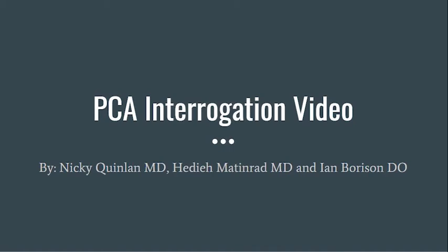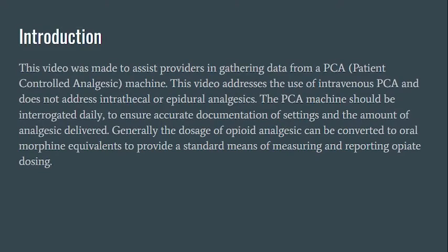This video was made to teach providers how to interrogate a PCA pump. This video was made to assist providers in gathering data from a PCA, a patient-controlled analgesic pump. This video addresses the use of an intravenous PCA and does not address intrathecal or epidural analgesics.